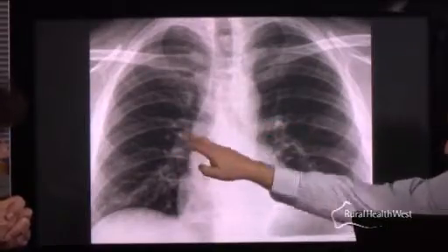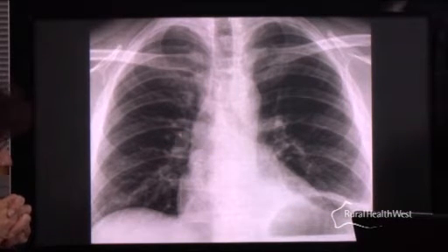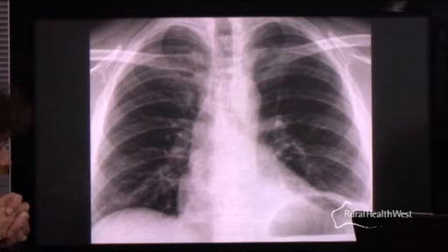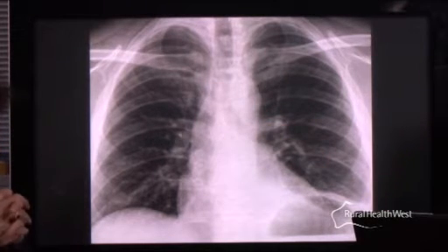And you said mediastinal lymph nodes. Yes. Can you just point out where those would come up, where we would see those? So mediastinal nodes, the hilar nodes live around these areas where you see the pulmonary arteries and pulmonary veins draining, leaving and exiting the mediastinum, and then you'll often see paratracheal lymph nodes running up and down adjacent to the trachea, and there's an azygos node which just lives there, which relates to the azygos vein.